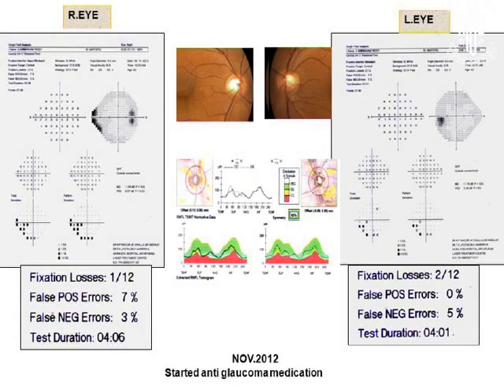And in this group, the age of the patient is very, very important. When you are suspecting glaucoma, you have to enter the age correctly. In an advanced case of glaucoma, the age can be relaxed on either side by 4 or 5 years, no problem. But in a suspected case, everything should be meticulous, because the normative data of that age group will be compared. So with age, you should take all the precautions.